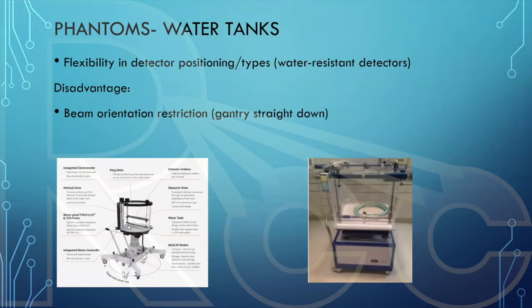For example, for this one, you have to use the same vendor. My detectors from the square water tank, I cannot use them in the round water tank. And that's something that you have to keep in mind when your clinic is buying the equipment. If you are involved in the buying, each institution is different, but keep that in mind.